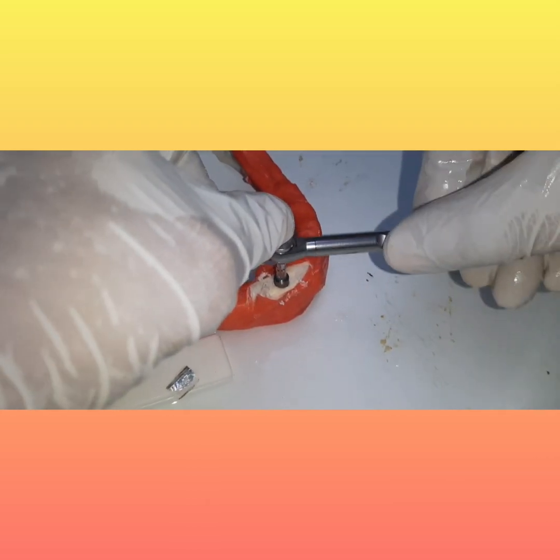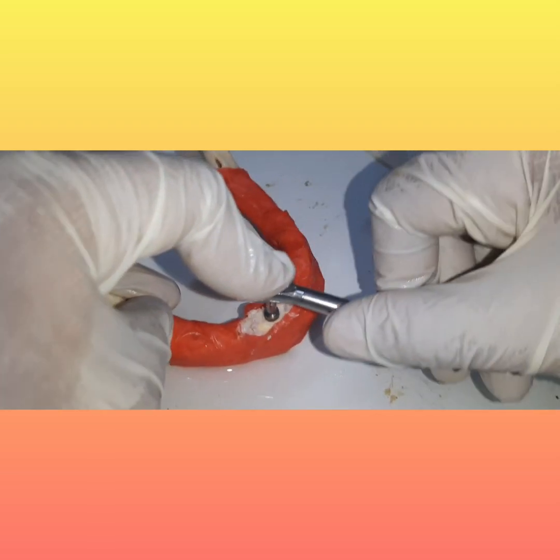And I'm going to place this ratchet over the driver like this, and then I'll be placing the implant inside this. With the help of the ratchet, I'll be tightening the implant like this.